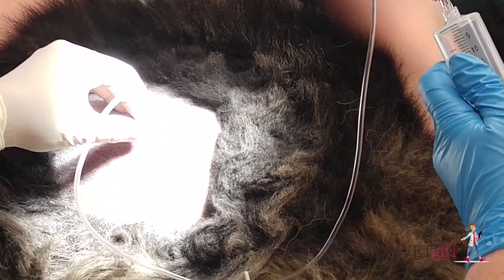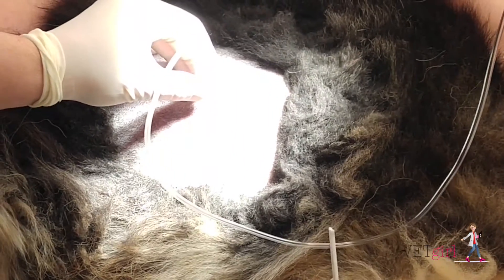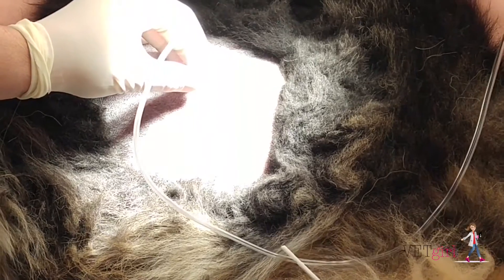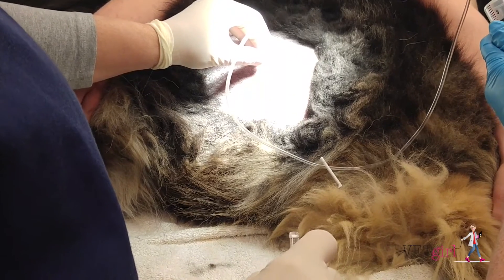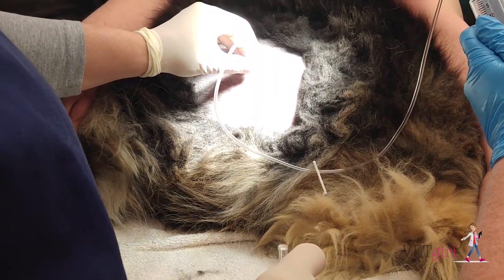In this video, an unknown-aged male neutered German shepherd dog presented after being hit by a car. The dog was diagnosed with a pneumothorax and stabilized with intravenous fluid therapy, analgesics, and thoracocentesis. Due to financial limitations, the owners authorized an autologous blood patch pleurodesis for treatment of the pneumothorax.